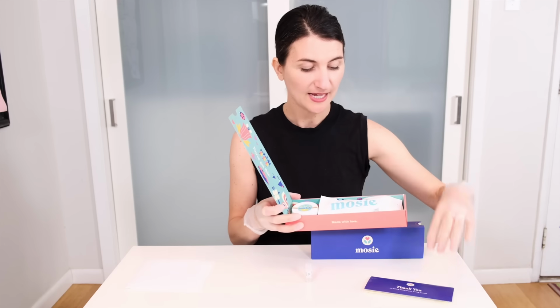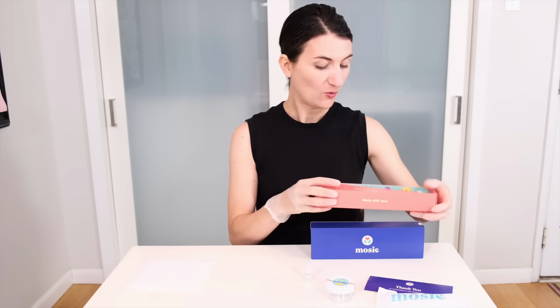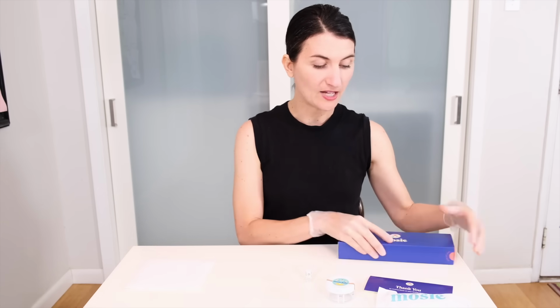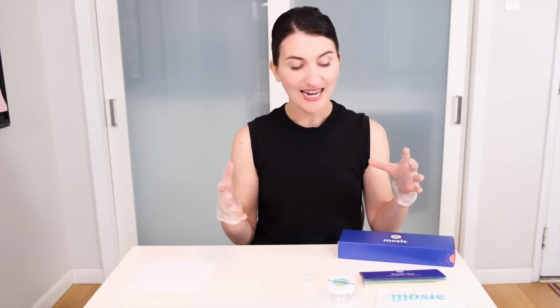So I'm gonna open up our Mosie kit here. Inside we have our instructions, our syringes, it comes with 2. We're only gonna use 1 today, and the collection cup. We recommend that you open up the kit prior and you take a look at the instructions. This includes information about the actual insemination that you'll do, but it also has information on the back about ovulation. And we recommend that prior to even ordering your sperm, prior to getting to this point, that you have been tracking your cycle, you know when you're ovulating. This is a huge purchase and it's a huge endeavor, obviously, so you're probably already doing that, but just in case, I mention it here, anybody who's doing home insemination, you'll want to have a good idea of when you are ovulating ahead of time.